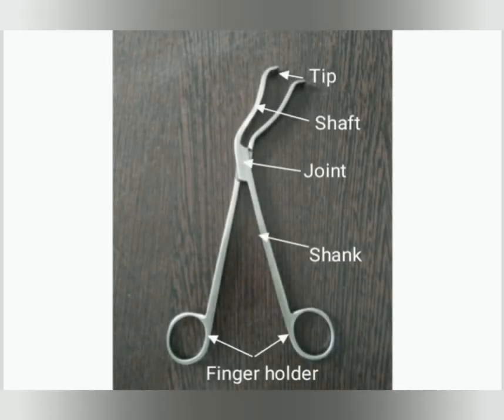Now let's discuss about the parts of the Cheatle forcep: finger holder, shank, joint, shaft, and tip with serration.